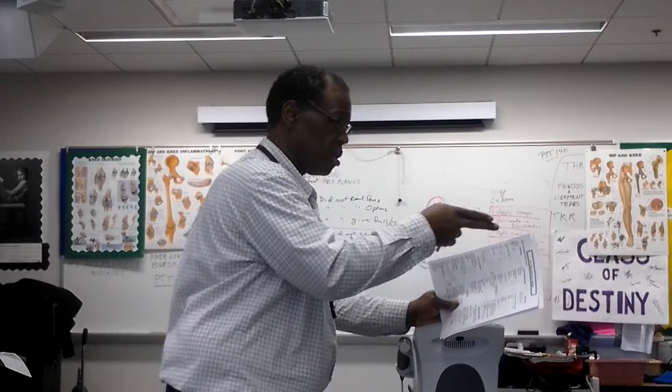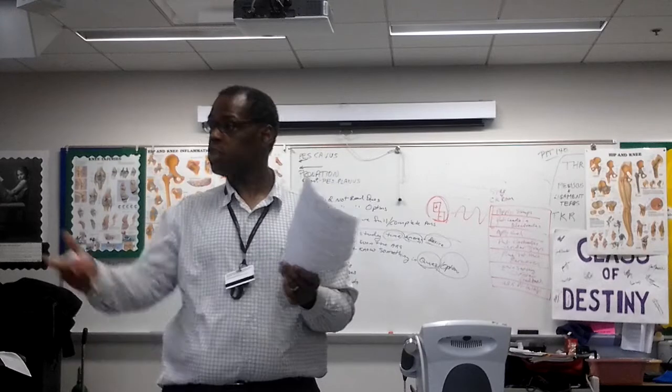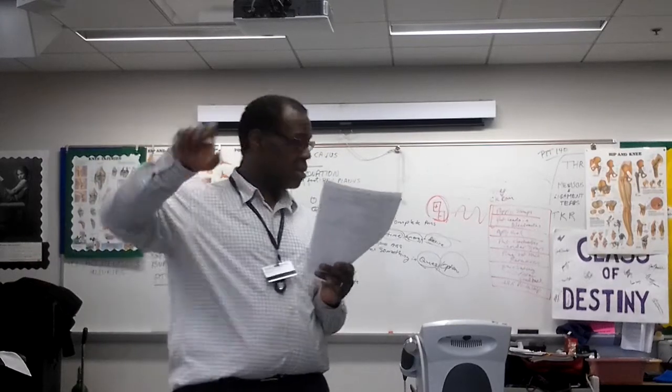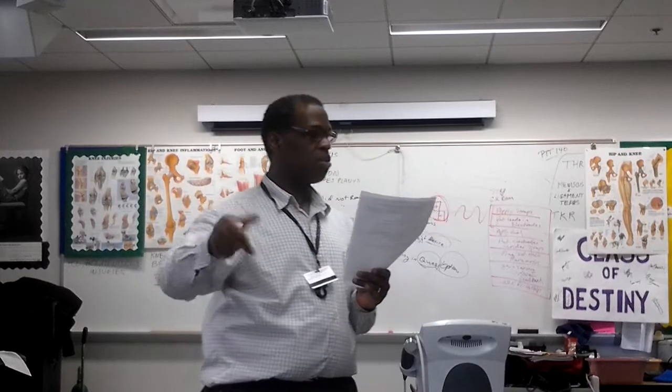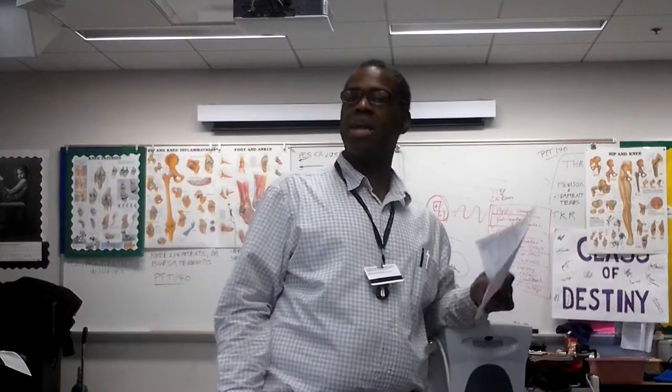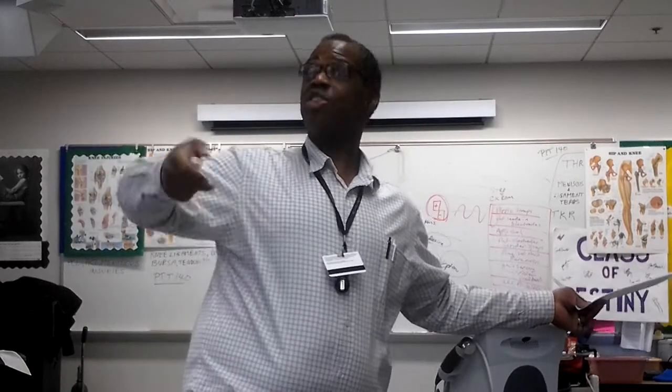Sensory. Good. I have to keep turning to do what? Reach motor. Okay. But the button makes the difference between sensory or motor based upon if I turn it up. So if you say, I'm not getting it, I'm not getting it, you're probably not getting it because of what? You didn't turn it up.